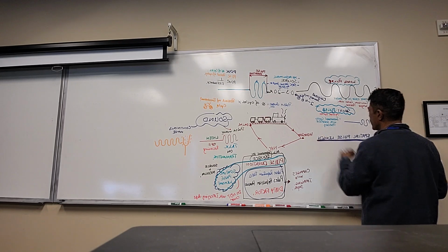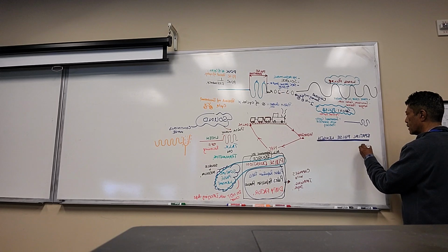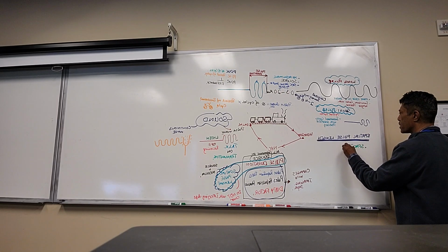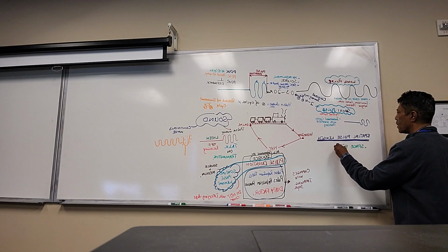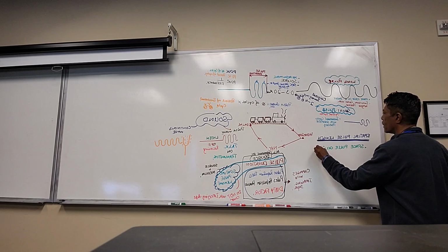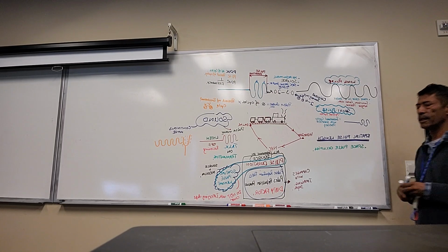It's basically the space a pulse occupies, right? That's the spatial pulse length.